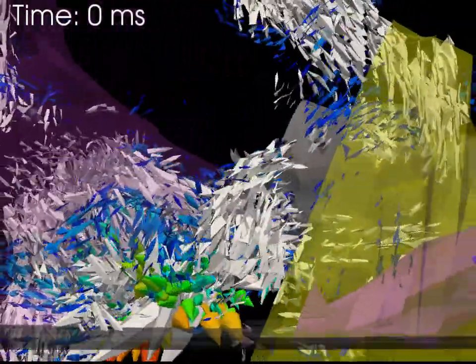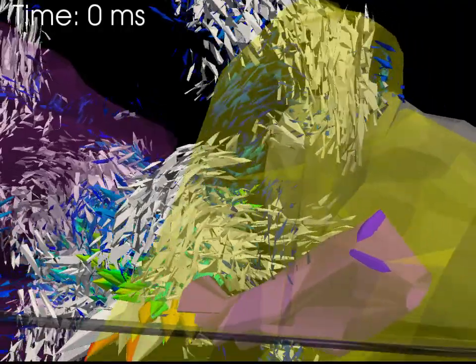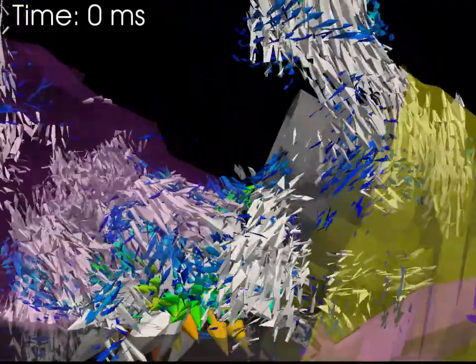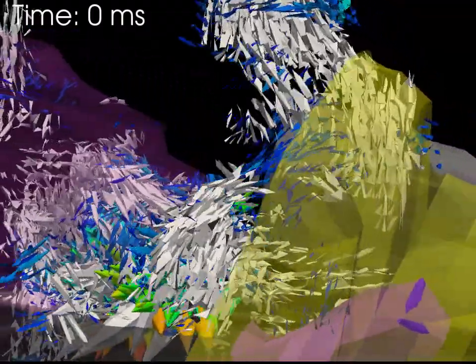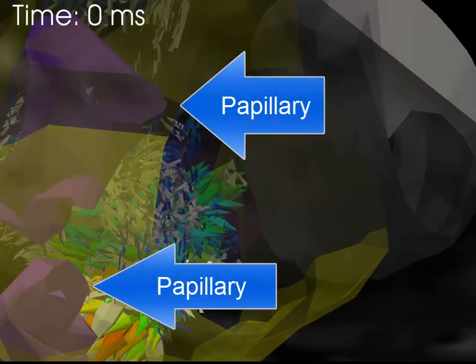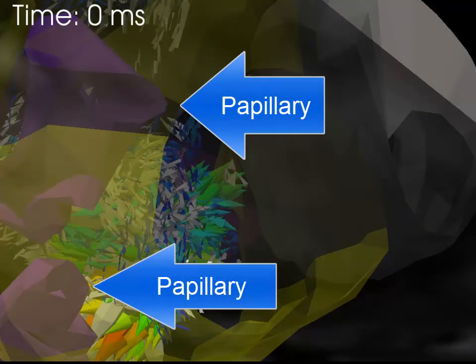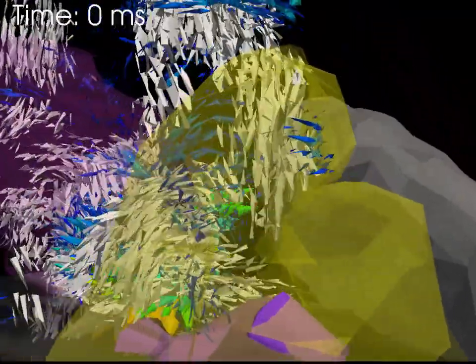Here in early systole, flow in the ventricle consists of motion into the regurgitant tricuspid jet and flow into the main pulmonary artery. We have included a preliminary segmentation of the papillary muscles, which are somewhat hypertrophied in this pulmonary hypertension patient.